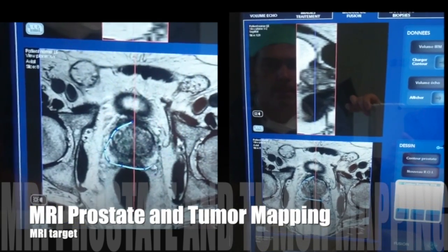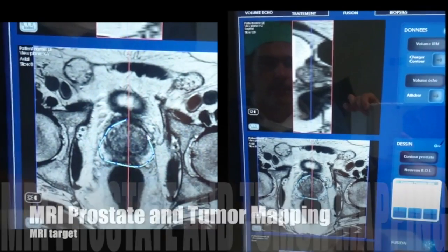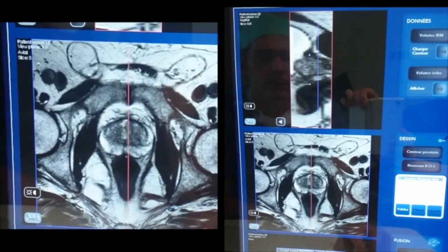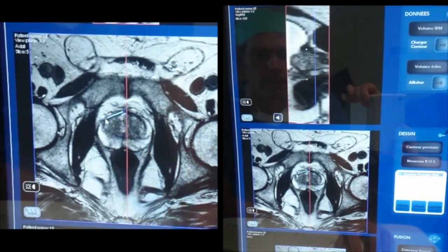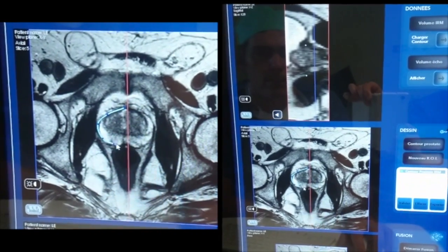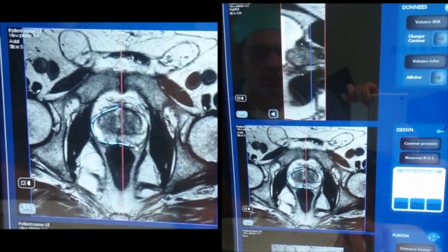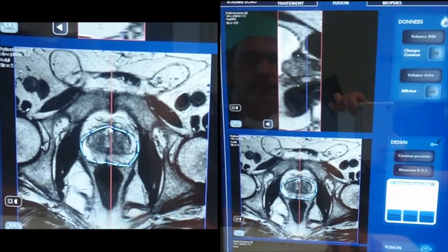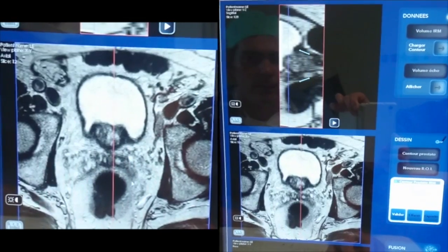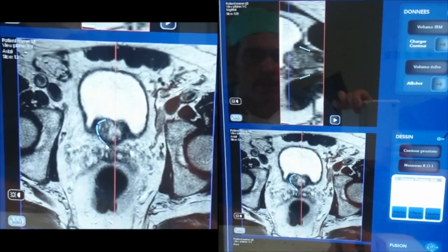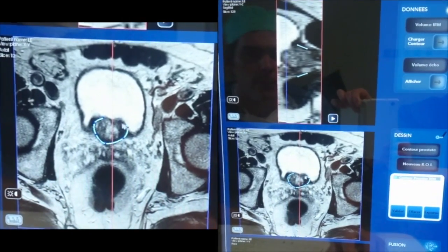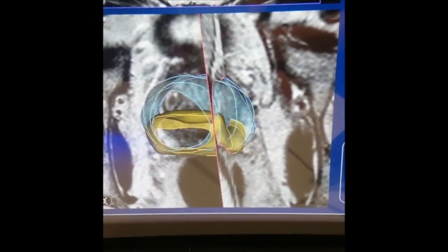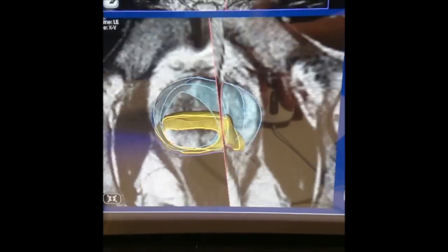The screen planning allows the import of MRI sequences to perform prostate mapping and define the target tumor with the margin security. You just need to draw the prostate at the apex, the middle, and the base of the prostate. You can see the 3D cartography of the prostate and the target tumor.